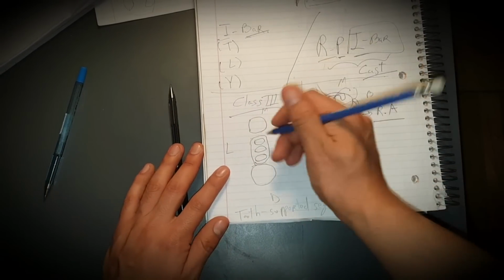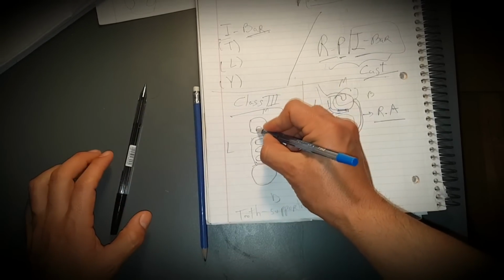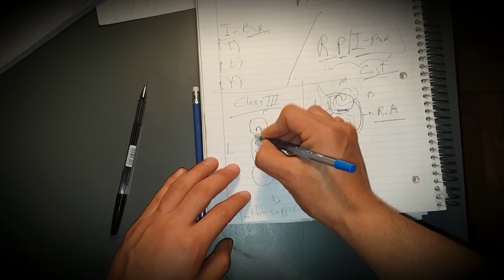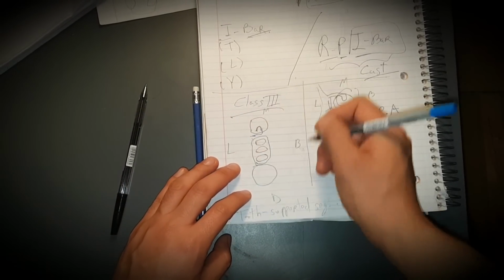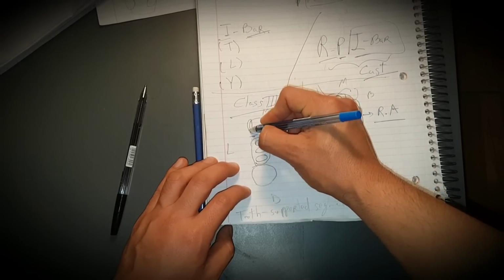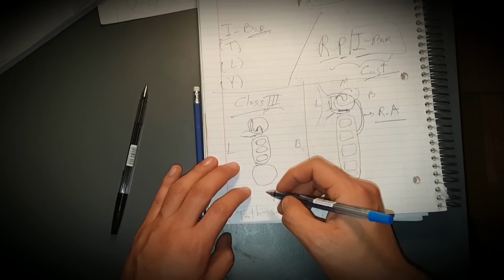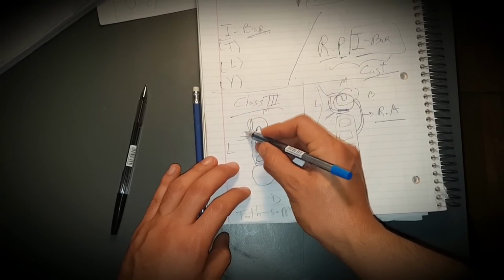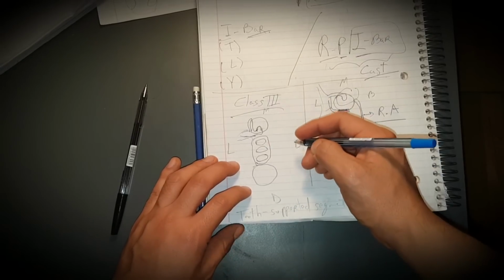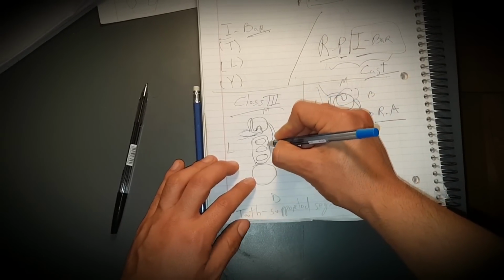So we have now a distal rest. I have the guiding plane, which comes there, and we have a reciprocal arm. It follows the structure there. The minor connector follows the structure. But now, the bar comes there.